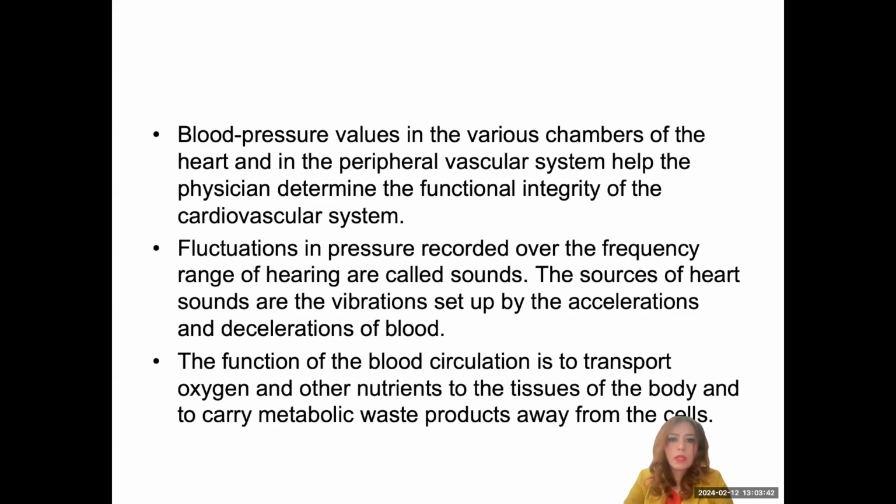So we talked about blood pressure details and how blood pressure is produced in our previous course. Now, we will look at the details of blood pressure measurement. Fluctuations in blood pressure recorded over the frequency range of hearing are called sounds, and the sources of heart sounds are vibrations set up by accelerations or decelerations of blood.